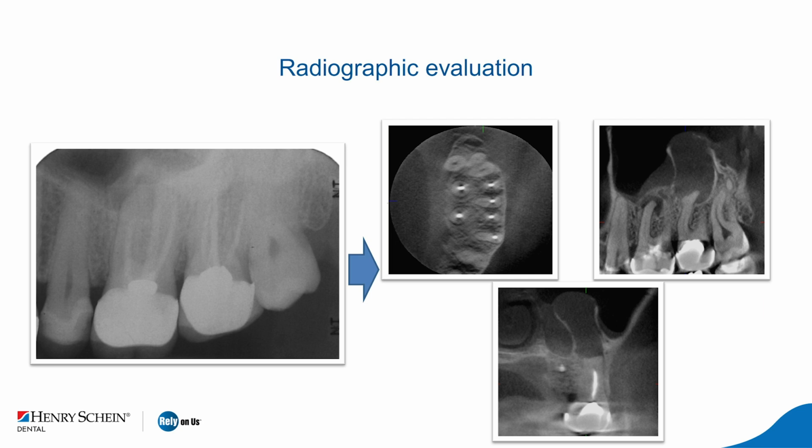And you see on the mesial apex of tooth number 15 that there is a large radiolucent lesion pushing or displacing the floor of your maxillary sinus superiorly, with the radiodensity of soft tissue. It looks like a radicular cyst, but of course we need a biopsy to do the final diagnosis. But definitely there's something going on there.